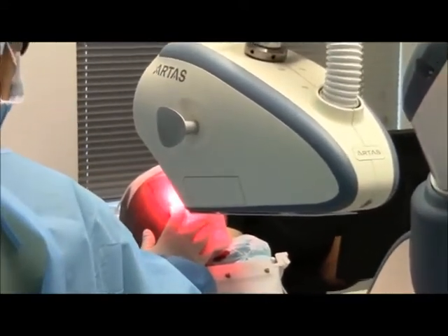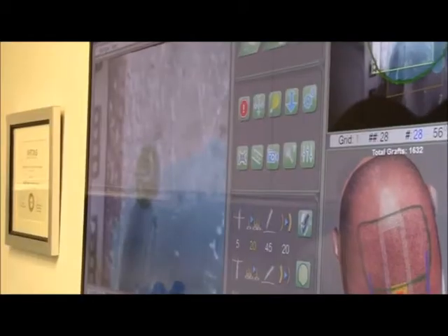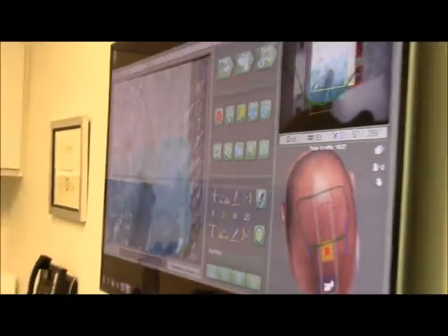I'm going to take a look at the side view of the robot actually working. It goes pretty quickly — it can do about up to 2,000 recipient sites an hour. Although the actual procedure takes longer than that because you have to remove these fiducials usually about three or four times in the field that we're doing.